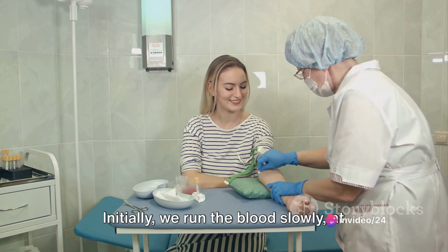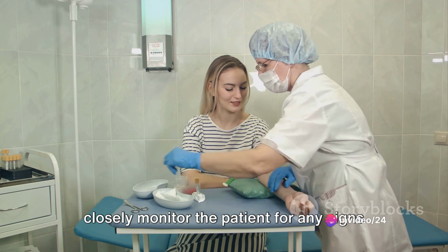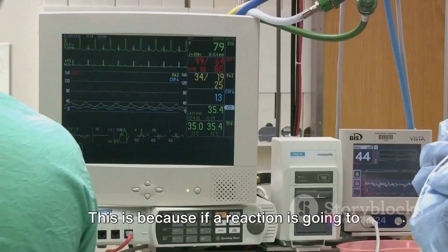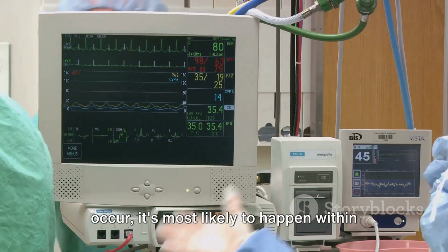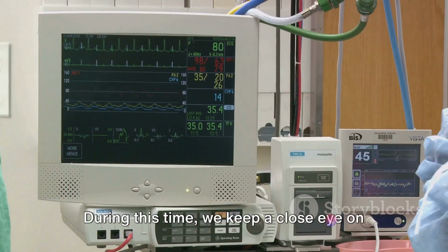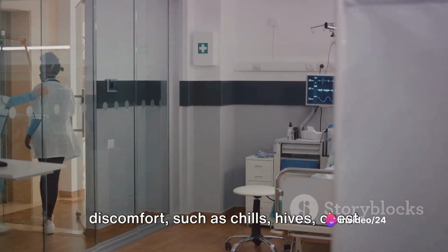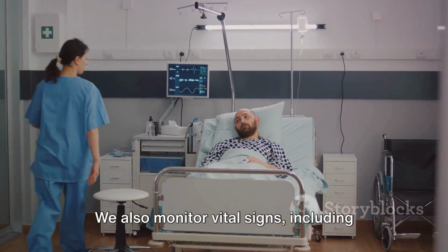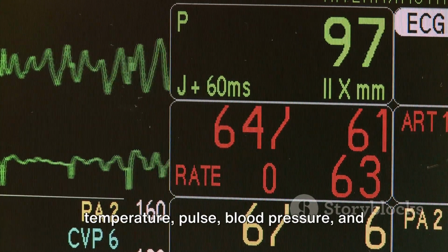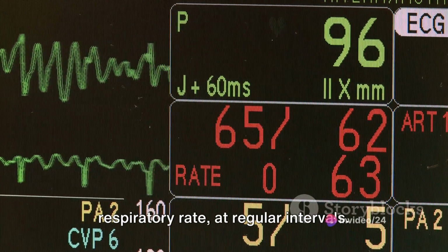Initially, we run the blood slowly, at about 2 milliliters per minute, and closely monitor the patient for any signs of a reaction. This is because if a reaction is going to occur, it's most likely to happen within the first 15 minutes. During this time, we keep a close eye on our patient, looking for any signs of discomfort, such as chills, hives, chest pain, or difficulty breathing. We also monitor vital signs, including temperature, pulse, blood pressure, and respiratory rate, at regular intervals.